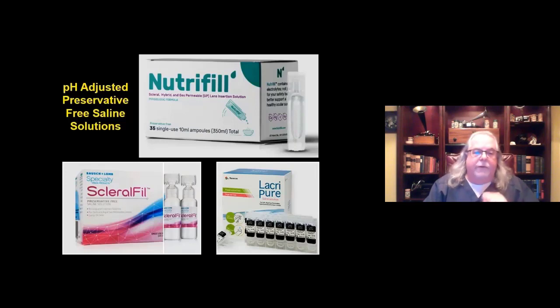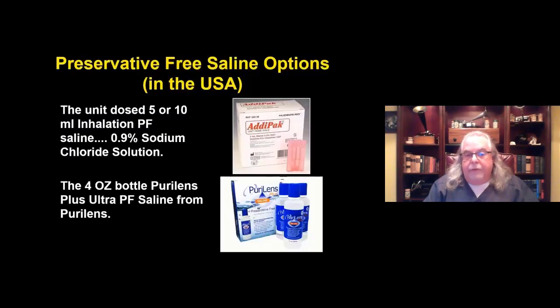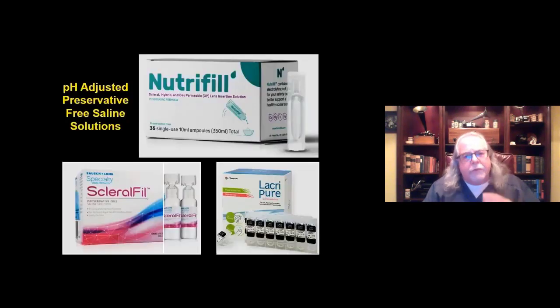Here are some of those that are currently on the market, and the other is the Purolens, that is also a pH balanced solution. So we do have some wonderful products to choose from. And since we did that study and adopted this new philosophy, we have definitely served our patients better, especially our dry eye patients.